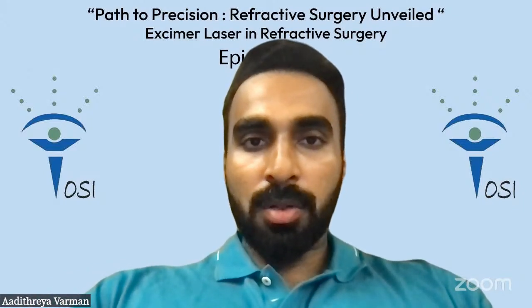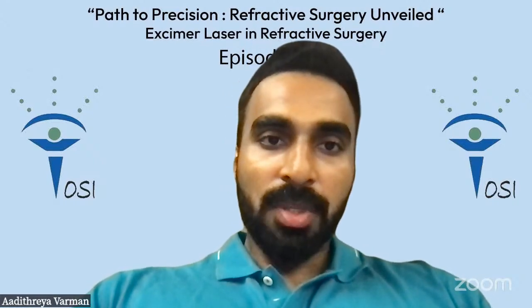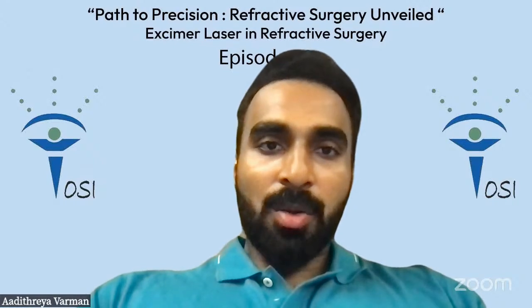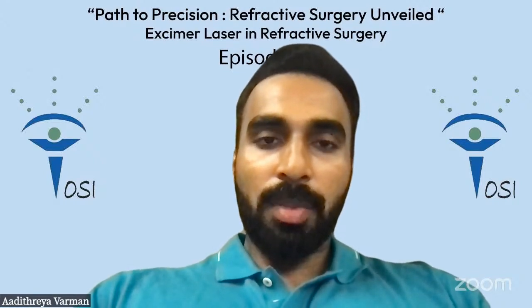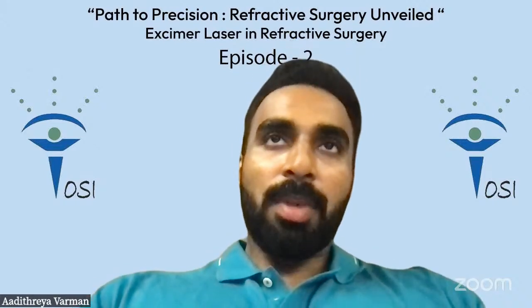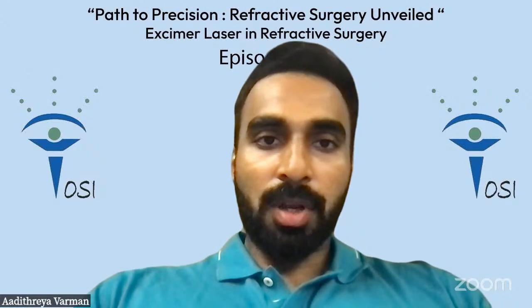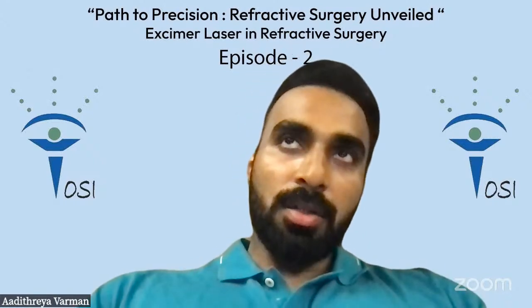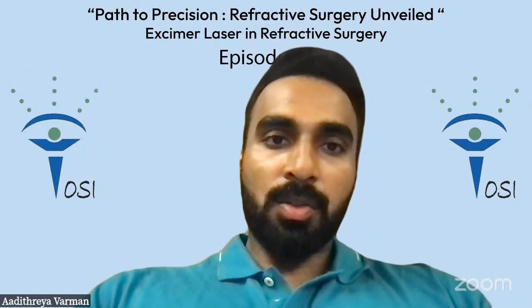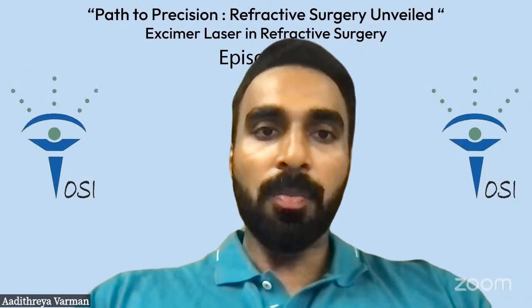If you follow this, you'll be very surprised that you will not get any microfolds at all. And you won't know that there are microfolds unless you stain. So we have to make a habit of staining every patient immediately post-procedure. Microfolds don't just affect quality of vision, they might also affect your refraction as well. Sometimes a patient with a -1 cylinder, we just iron out the flap and remove the microfolds, and it goes almost to plano.